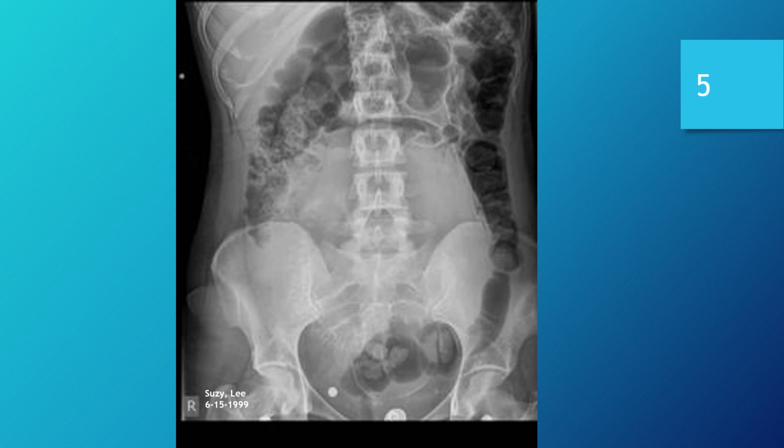Okay, so starting with number one, is the required anatomy present on this exam? Well, taking a look at this image, my conclusion is this is a supine abdomen, and the reason for that is because I cannot readily identify any air fluid levels.